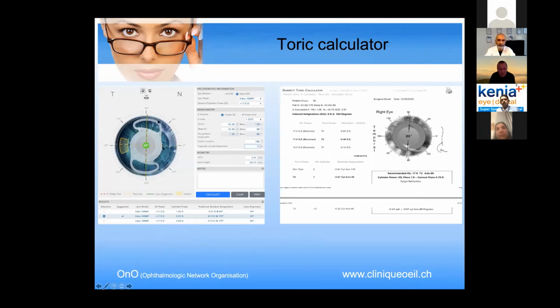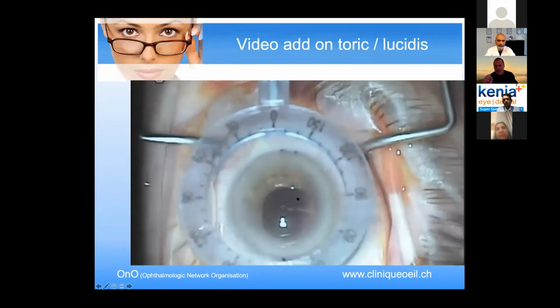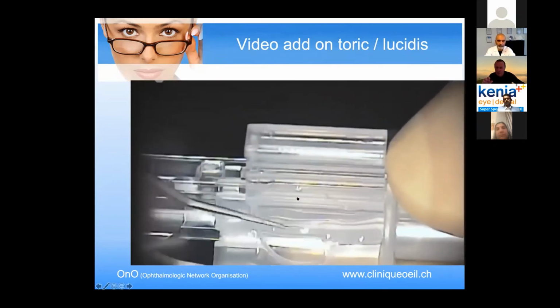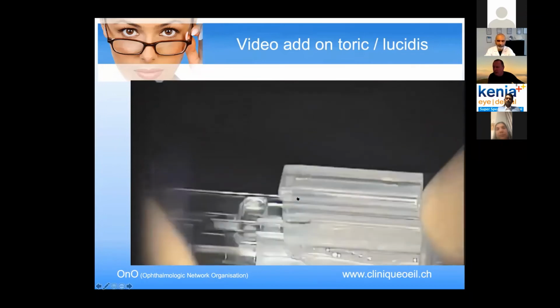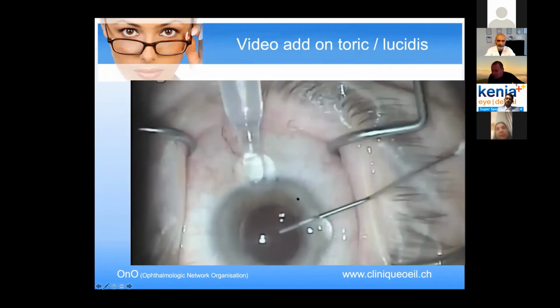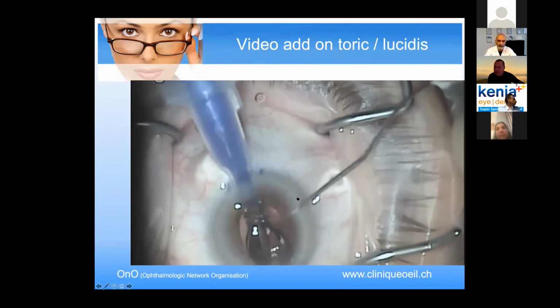We use a toric calculator from SAV, which is absolutely correct, and it's interesting. If you see your incision, you will see the lens moving, and we use the Barrett calculator for all the toric lenses. I will show you my joker, because when you are not exactly on the target with your Lucidis, the people are not perfectly happy. So we put in the bag an add-on lens from your country, and I love these lenses because you can correct 0.75 or 0.5 with an astigmatism of minus 0.5, and then when you correct everything, the people are very happy, and that's doing exactly what the people expected with just a little correction.